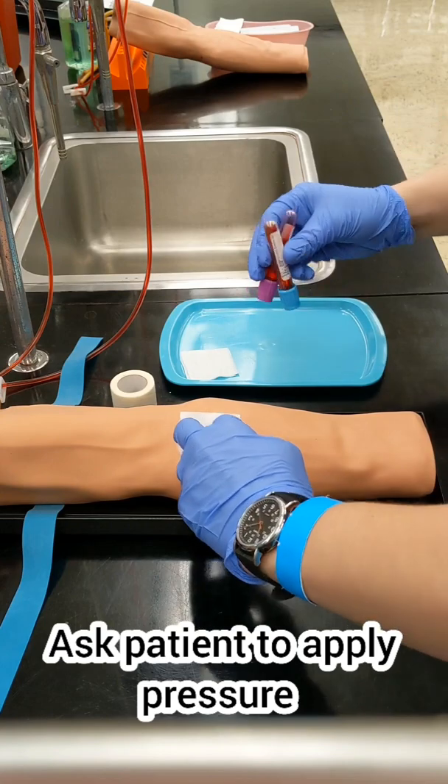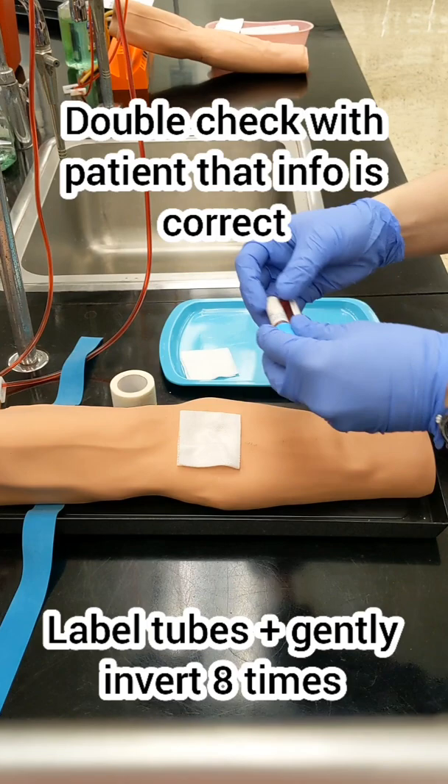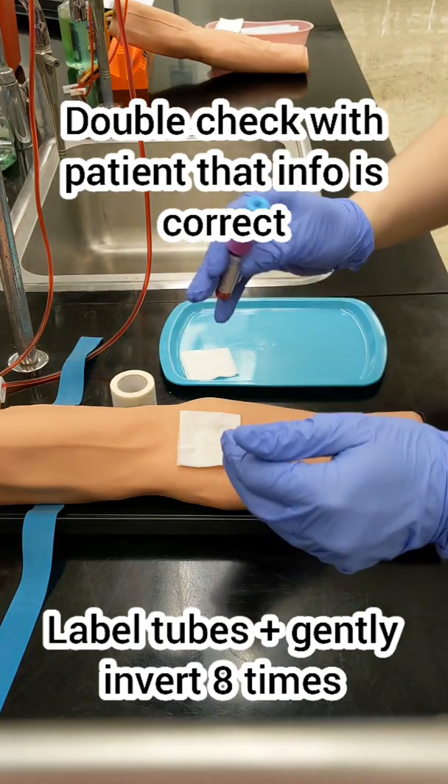Invert your tubes gently about eight times, and then either write or apply your pre-printed labels. Double check with your patient that you have the correct information there.